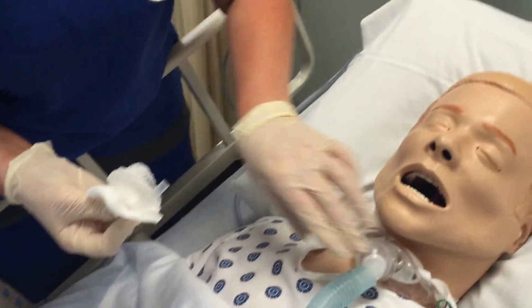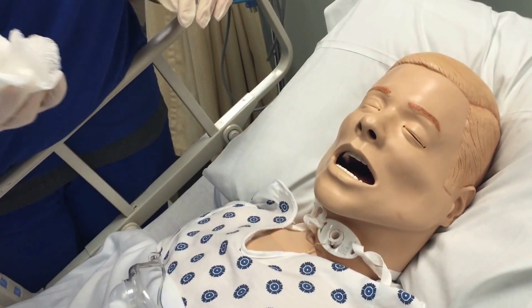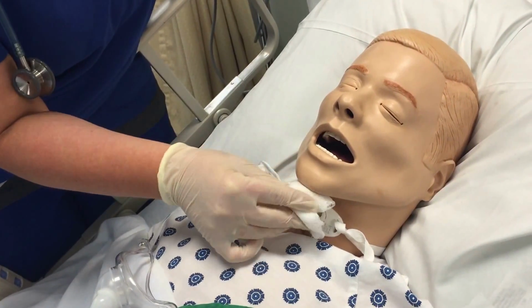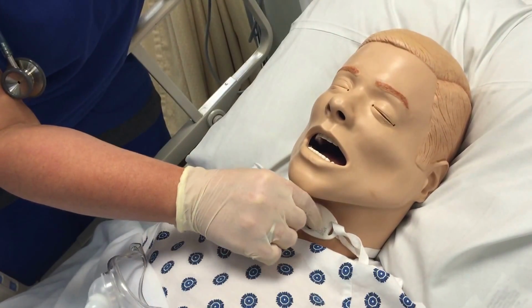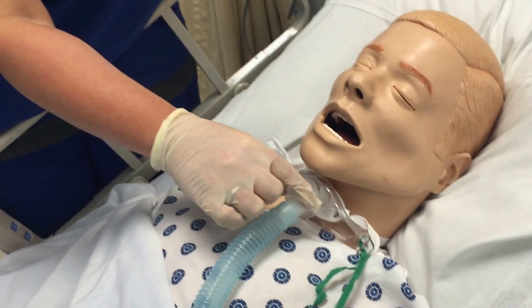Okay, Miss Dan, I'm going to put this right back in, and this is actually going to help you for dexterity. Put this back in. Try not to touch anything on the way back in. And as it goes in, you're just going to lock it, and it just snaps back in.